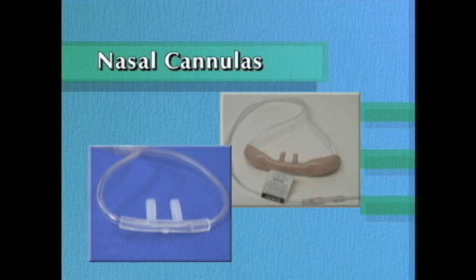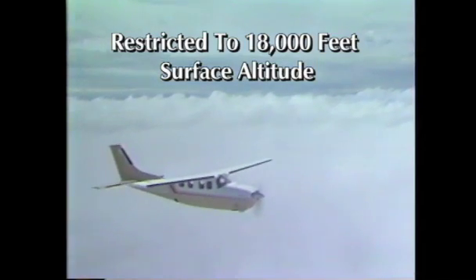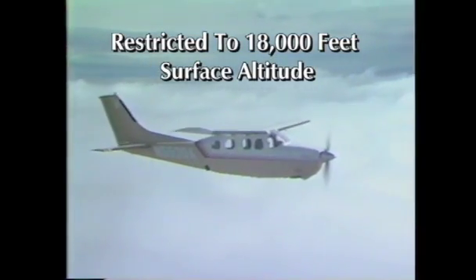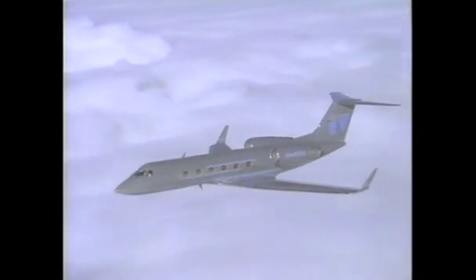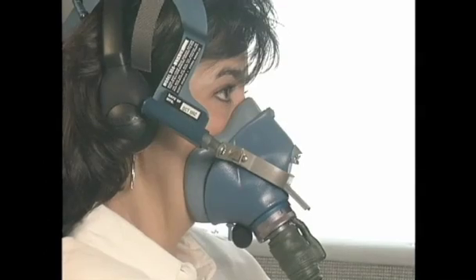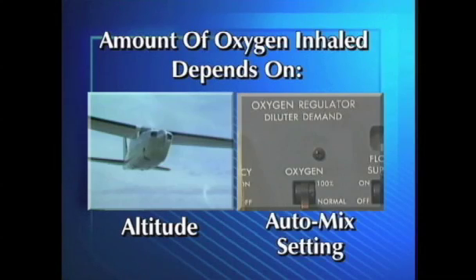Nasal cannulas are also continuous flow devices and offer the advantage of being more comfortable. They are restricted by federal aviation regulations to 18,000 feet surface altitude because blood oxygen saturation levels can decrease if one breathes through the mouth or talks too much during flight. With increased aircraft technology and altitude ceilings, two additional masks were developed. The diluter demand mask is designed to facilitate an air and oxygen-tight seal to the face. The amount of oxygen inhaled through the mask is dependent upon the altitude and the setting of the auto mix lever.